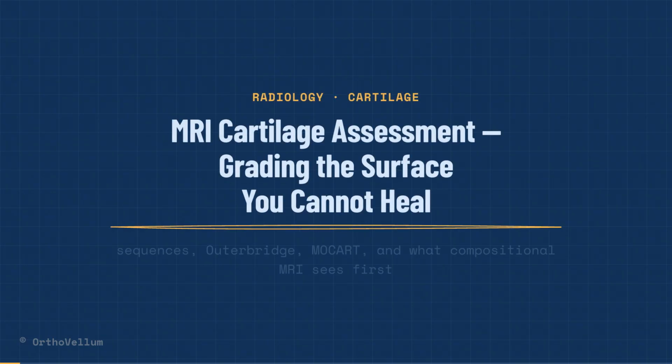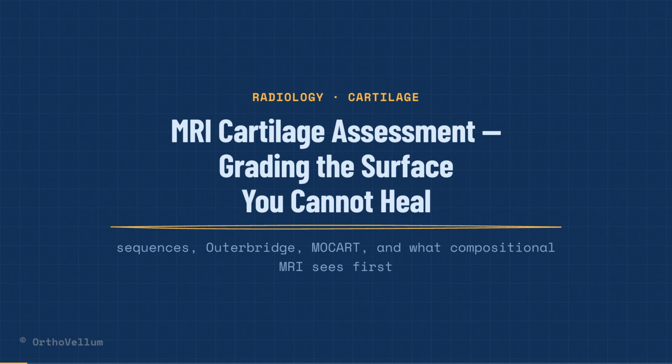MRI cartilage assessment, grading the surface you cannot heal. The sequences, Outerbridge, MOCART, and what compositional MRI sees first. 2 to 4 millimeters is all you get.